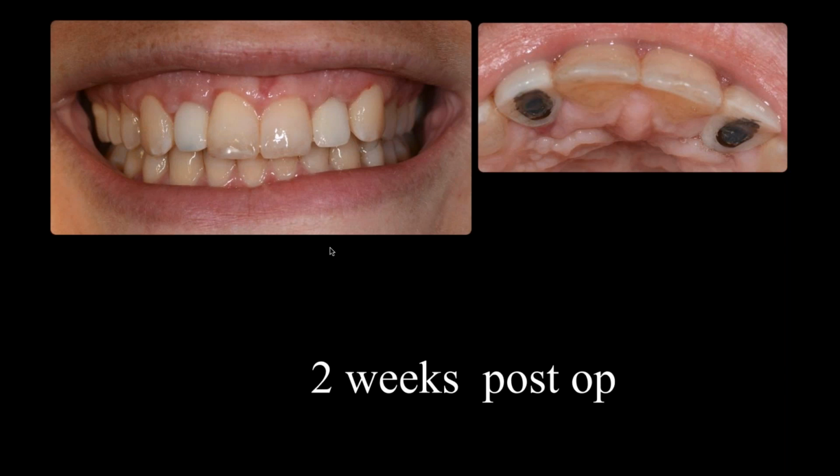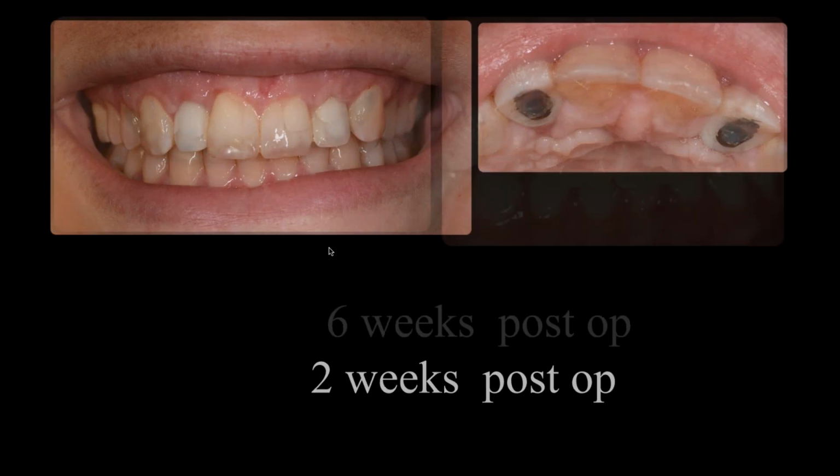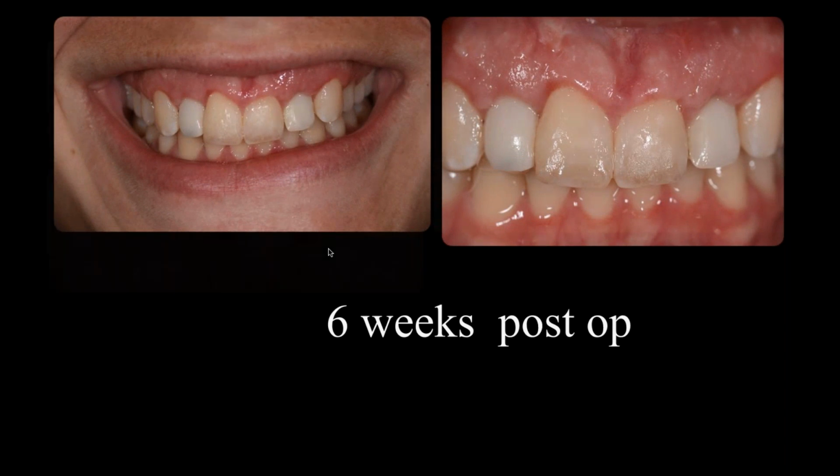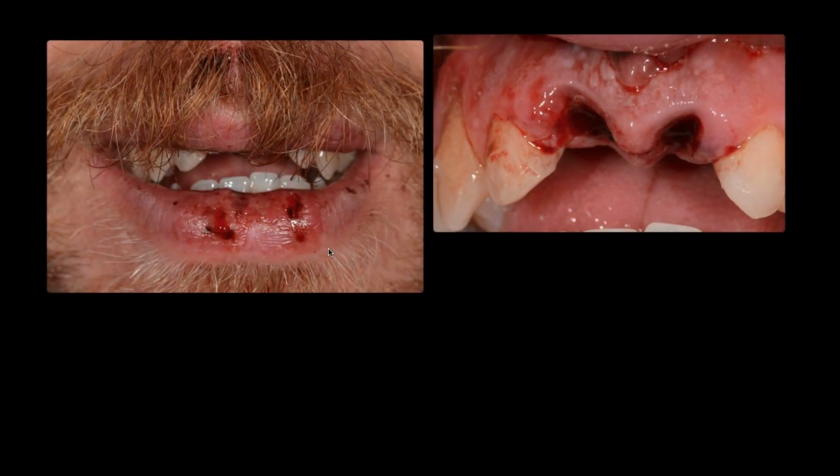key. And the reason I was able to do this was because of the imaging that we did, the planning that we did, and then of course the rest of it. So she's going right along. She's getting her final restorations done right now, which should be quite attractive for her. Now the other thing you can do is figure out some trauma cases or some other cases.